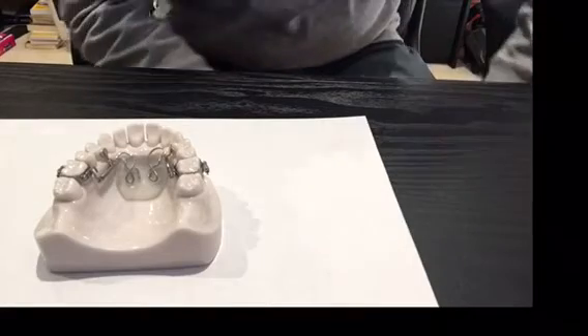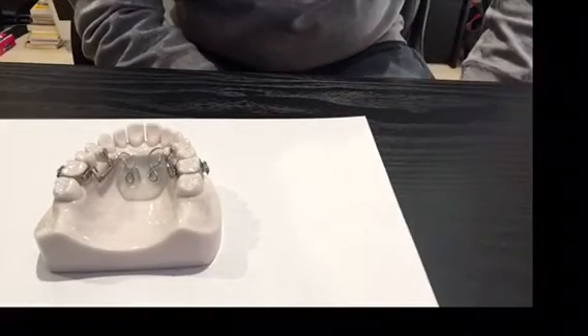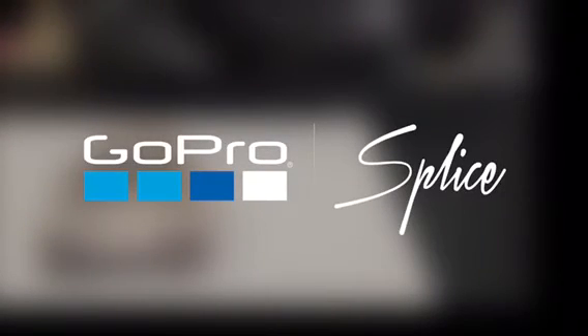You can do that on both sides or just one side if you need to, and that's how you activate a distal jet appliance. I'm Graham Manley for Ortholab.